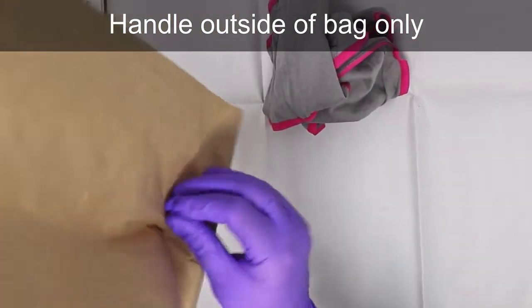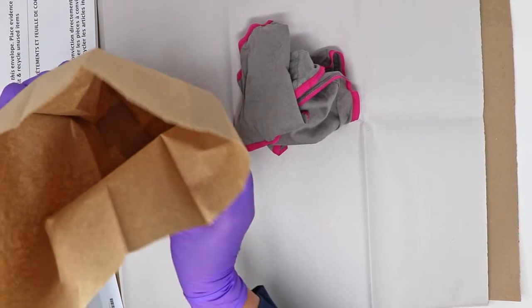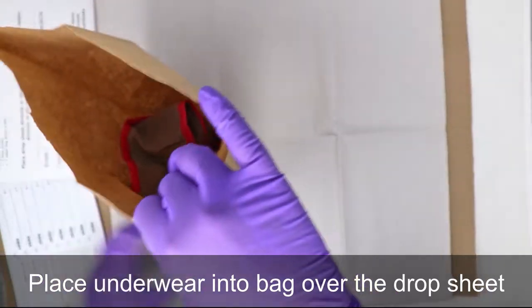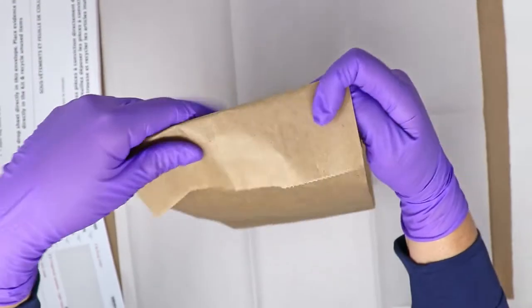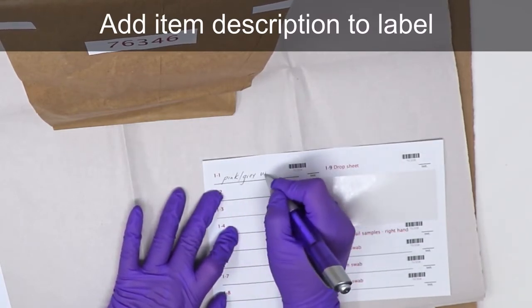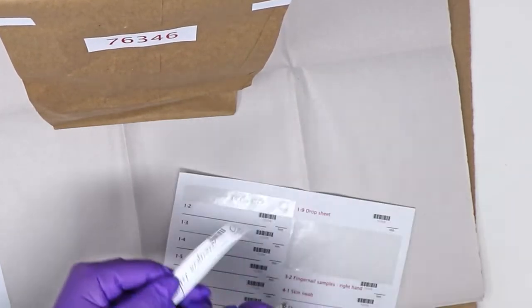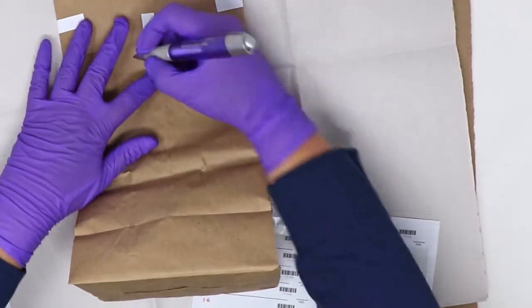When handling bags, this should be done with care to avoid touching the inner surfaces. Items can then be placed into separate brown paper bags over the drop sheet, once again to collect and retain any trace material. The bag can then be folded over and sealed using the white stickers provided with the kit. An item description should be added to the label. Here is 1-1 pink gray underwear, and initials applied to the label as well. This can then be adhered to the brown paper bag. Please note that you would not write on the seals or the bag on top of the drop sheet, and that this is for demonstration purposes only.